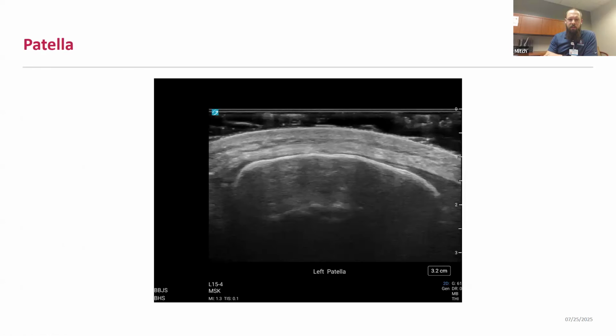Scanning more distally to the patella, you can scan the patellar cortex, looking for any cortical defects that may suggest underlying fracture, especially if there's point tenderness there with sonopalpation. This is where you'll also evaluate your prepatella bursa, which you want to make sure that you're not putting pressure on to distend any trace bursal fluid. So in this case, we're floating the probe across some ultrasound gel to make sure that we're not getting that compression there.